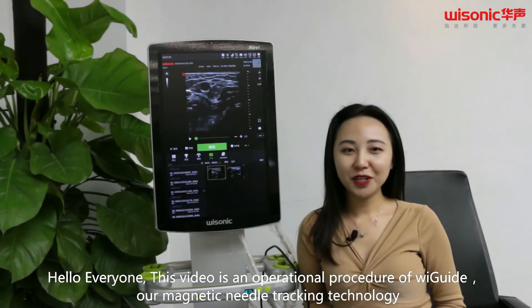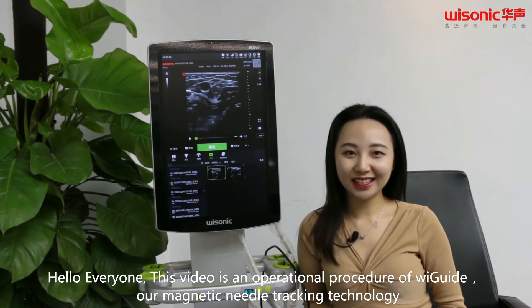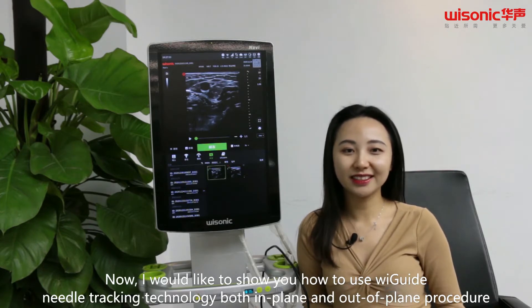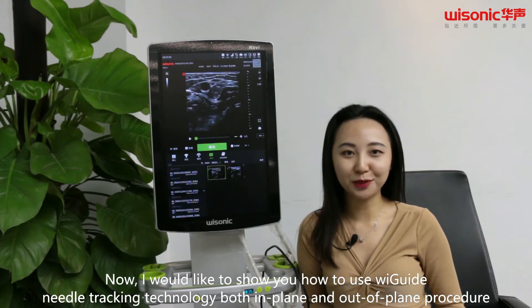Hello everyone. This video is an operational procedure of wiGuide, our magnetic needle tracking technology. I would like to show you how to use wiGuide needle tracking technology, both in-plane and out-of-plane procedure.